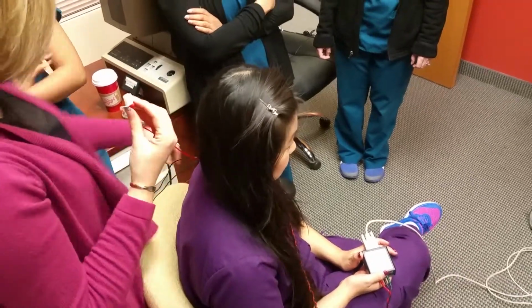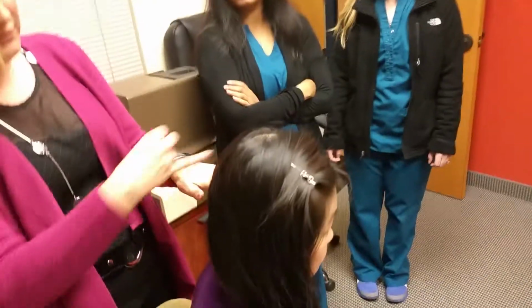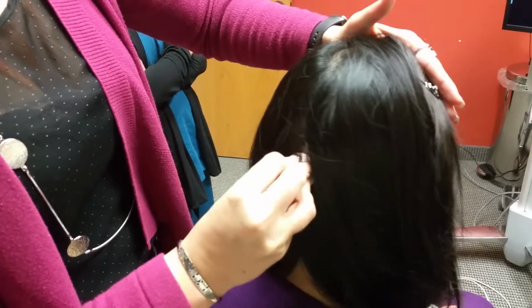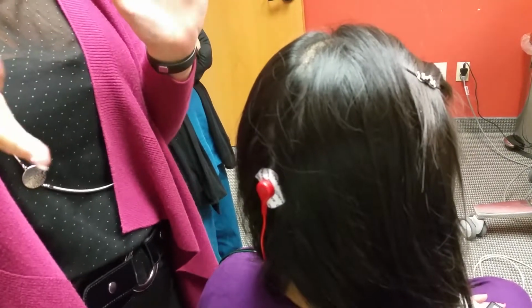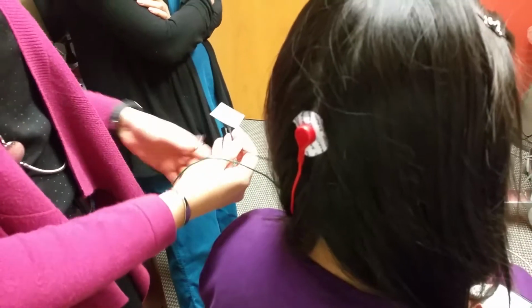Alright, so I'm going to have to see over here because I can't do anything from the left side. So we're going to measure, chin up nice and level. Make sure that we're in the right place. We want to get as close to her scalp as possible. We're going to hold her forehead and we're going to put all 5 fingers around this and we're going to wiggle it in. So it should actually be more of a cone shape instead of completely flat. If you press on that button, it's going to squirt your conductive paste out everywhere and you're not going to get a very good connection with her. So you want it to be more of a cone shape.